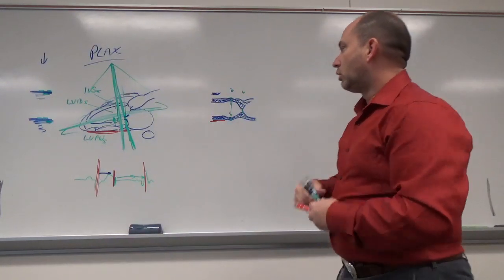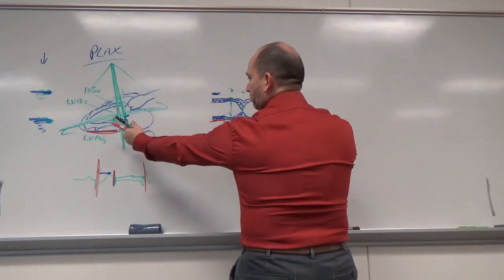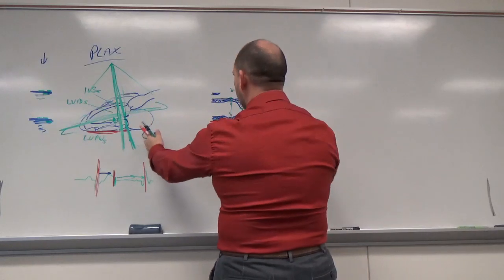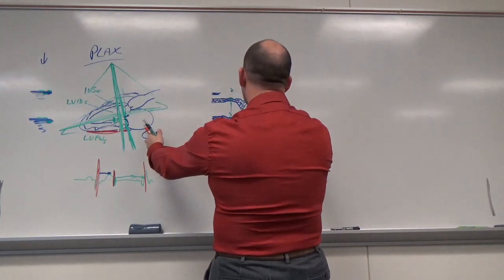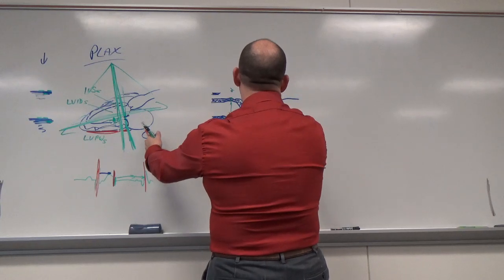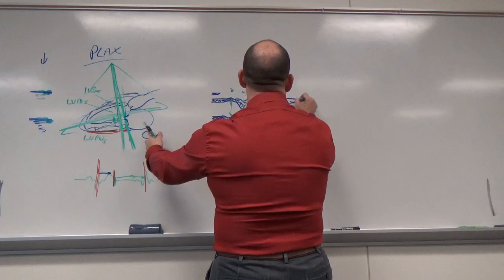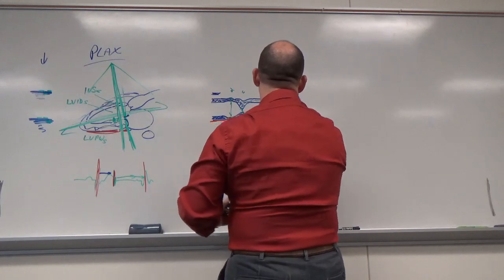Okay? So what do I see on M mode continuing on? I've just slid this beam, or tilted or rocked my transducer slightly, to be able to hit that level, because we're just past the tips of the leaflets. So now I'm going to see the walls and so on. They'll keep coming in as they do, going along, kind of coming out, dipping down, whatever. You're still going to see that, the same as before.